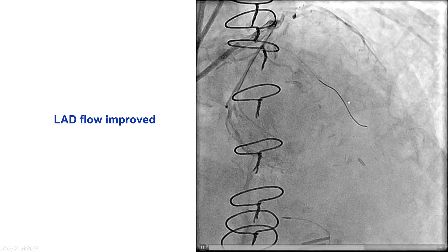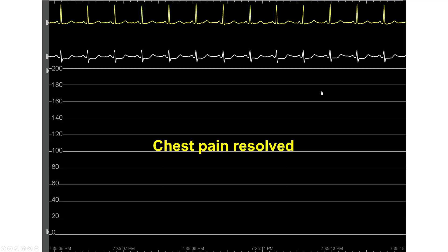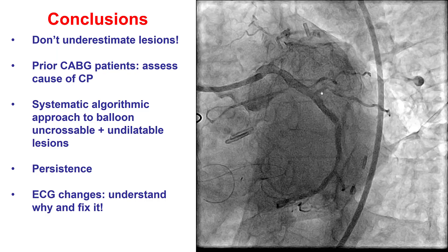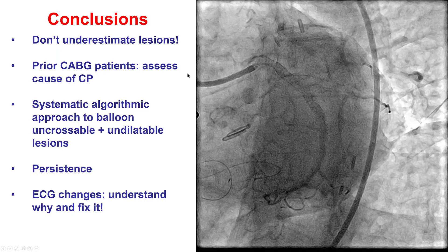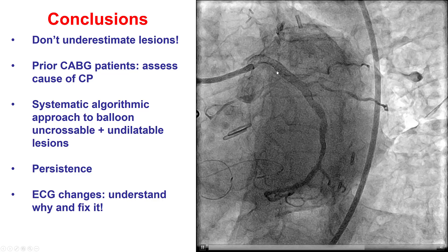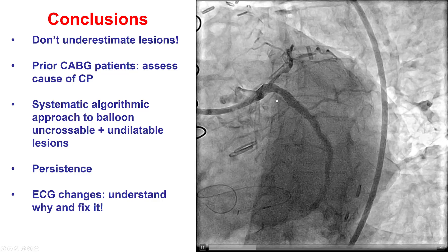Better flow was confirmed on the cranial projection as well. The patient's chest discomfort resolved, and then the EKG changes resolved as well. This was the final result — not perfect expansion, but a much better area in the left main and good flow into the LAD.